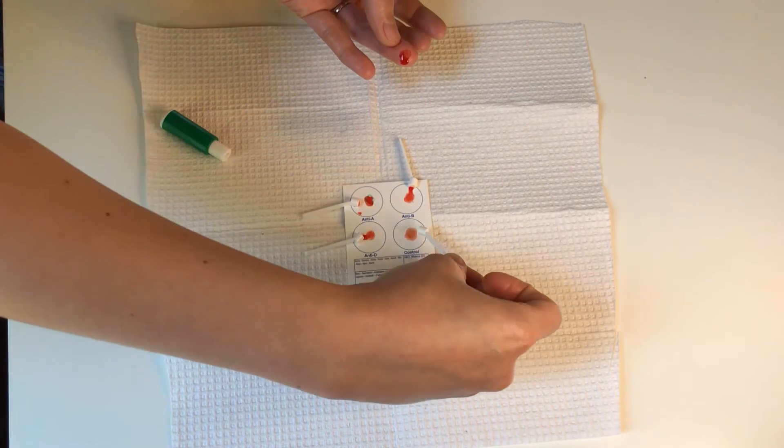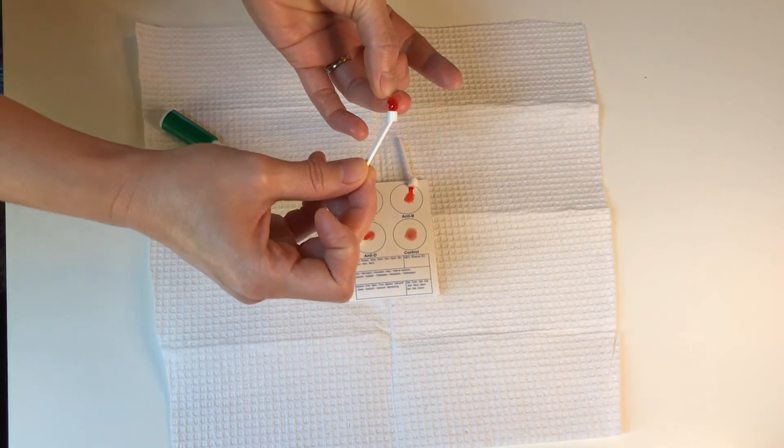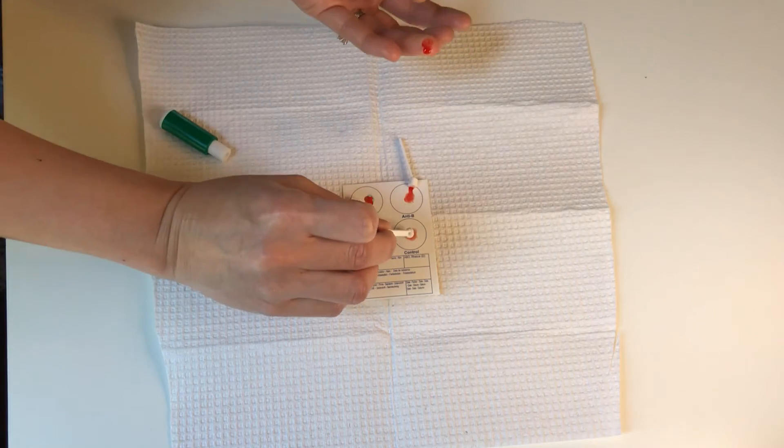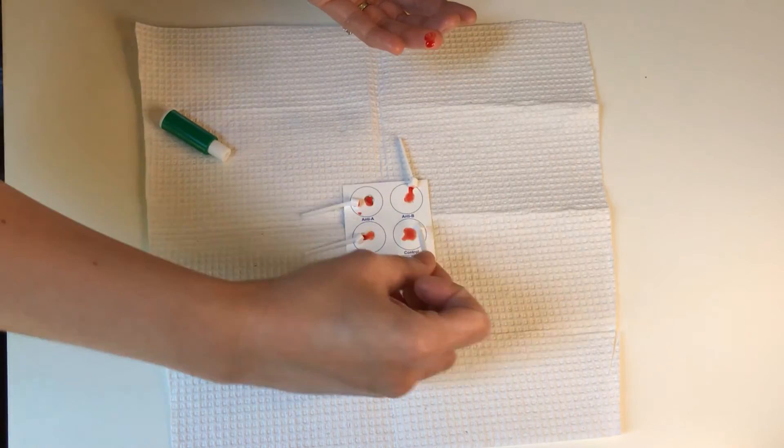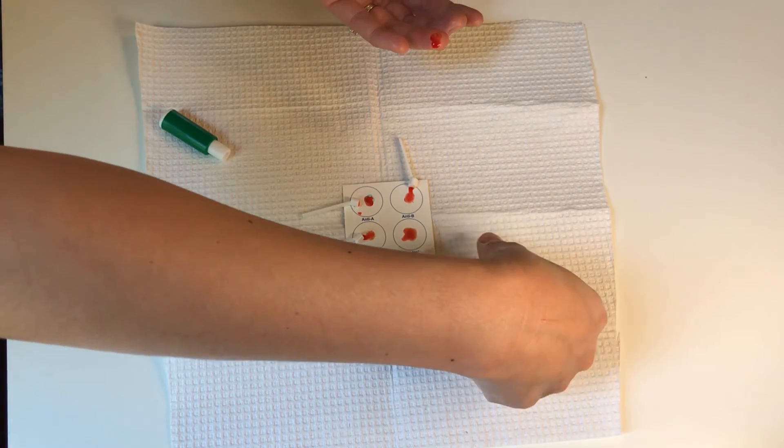We might want a little bit more blood on that one. Go ahead. That's okay. Do it that way. Put it on the control and then do the A one. Not the A, sorry, the D. Get a little bit more in there.